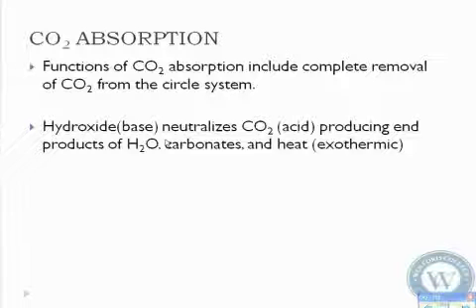All right, so your goal is you want all CO2 removed from the system. You do not want a patient rebreathing any CO2. You see that on your monitor. So on your monitor, you're going to see end-tidal CO2. That's a value. And then you're going to see inspired CO2 directly below that. That should always read 0. Okay? If it ever reads anything above 0, then you need to start troubleshooting.